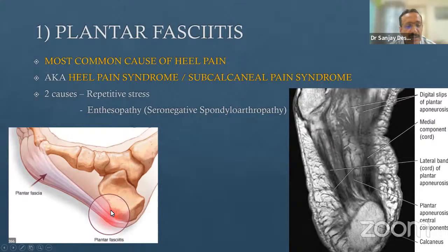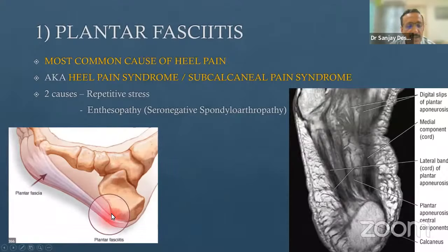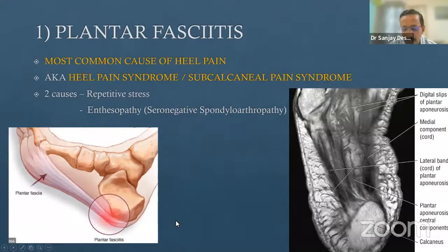Changes in the midfoot leading to collapse of the arch, or stress from overuse such as running, leads to repetitive pulling of the plantar fascia along the calcaneum. This causes spurring or enthesiophyte formation, first fibrous then osseous—called a calcaneal spur. By definition, a painful calcaneal spur will be bony and on MRI will show marrow edema. Thickening of the plantar fascia at this attachment is called plantar fasciitis.